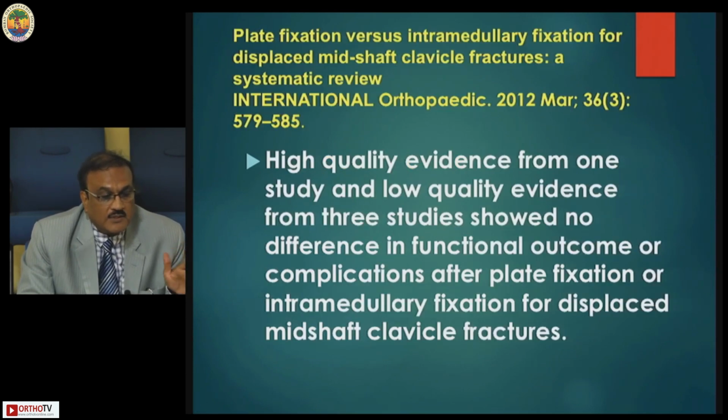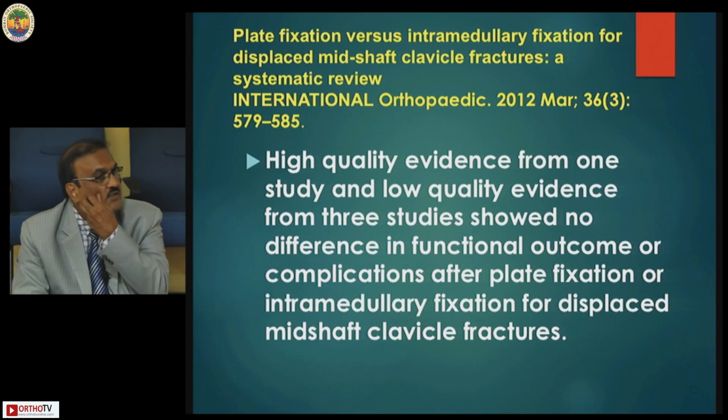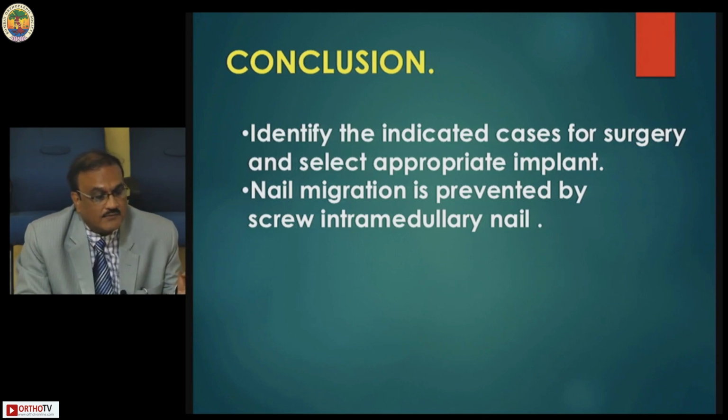So, plate fixation versus intramedullary fixation of displaced midclavicular fracture. High quality evidence from 1 study and low evidence from 3 studies showed no difference in functional outcome or complication after plate fixation or intramedullary fixation for a displaced mid-shaft clavicular fracture. So, if there is no difference after a treatment, if you can give a scarless surgery or a very small stitchless 1 or 2 surgery, it is always better. That is the contention. Identify the indicated cases for surgery and select the appropriate implant.